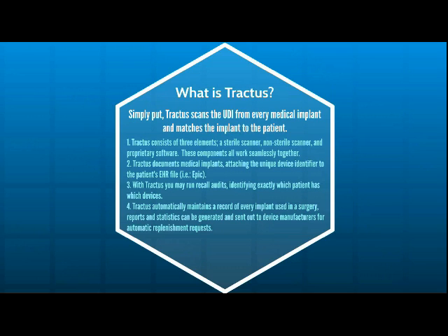And as everybody knows, we've been concentrating very strongly on the manufacturing process and things like that. We want to focus that attention on the patient and documenting those implants, and that's primarily what we would like to do here.